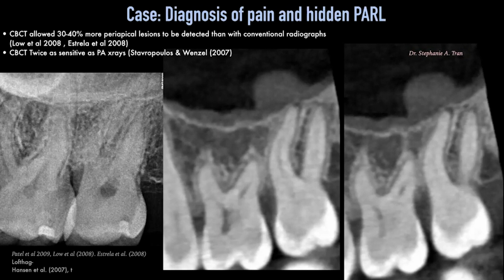So we can see in this example here that this patient, who I was diagnosing basically for pain, we're making endodontic diagnosis. When taking a CBCT, we can note not only that widened apical PDL, but we can also see that thickening of the sinus mucosa right over that same tooth where the symptoms were localized, as well as widening and thickening of that sinus mucosa right over the area of the widened PDL.